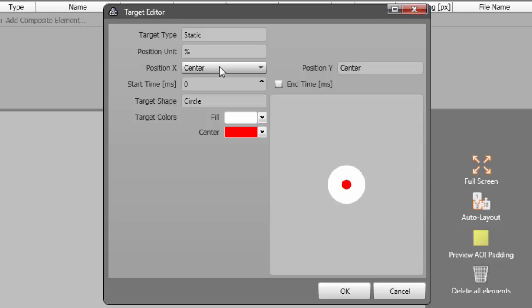We also want to define when the target will appear and for how long. I want this target to be displayed right from the beginning of the stimulus. So, I'll enter zero for the start time. And I want it to vanish after two seconds, which in milliseconds is 2000, the value I'll enter for the end time.